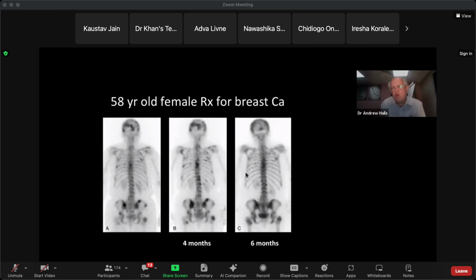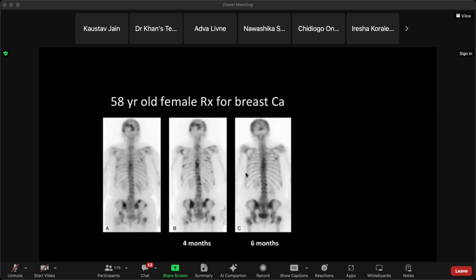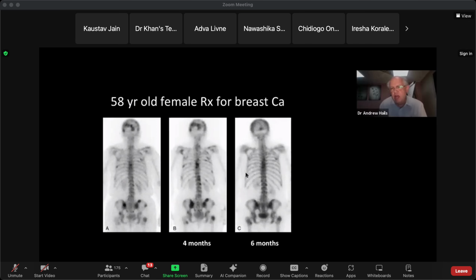Okay. So what would guide you in working out whether this was the disease getting better or worse? In normal practice, I would correlate with plain films or any cross-sectional imaging that's available. I'm assuming the patient will have 3-monthly CT scans as well, so I could go by the bone density and the bone abnormality in the cross-sectional and plain film just to guide me. That's right, yes. You couldn't really fully interpret this on its own, as you're saying. You'd need to have some other imaging as well.